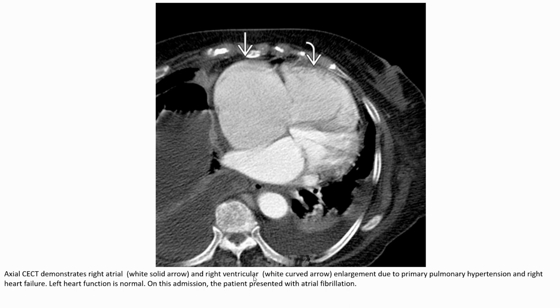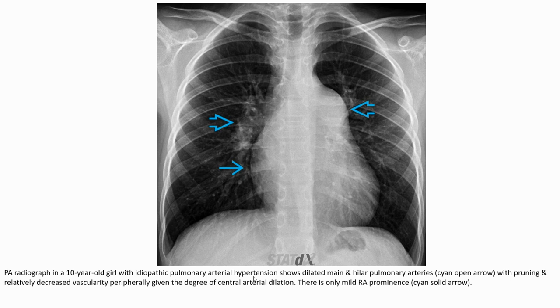On non-contrast CT, the image demonstrates right atrial enlargement. The solid arrow indicates the right atrium and the curved arrow indicates enlargement due to primary pulmonary hypertension. The patient presented with atrial fibrillation. A chest radiograph from a 10-year-old with pulmonary arterial hypertension shows dilation of the main and hilar pulmonary arteries with pruning and relatively decreased vascularity peripherally due to central arterial dilatation.